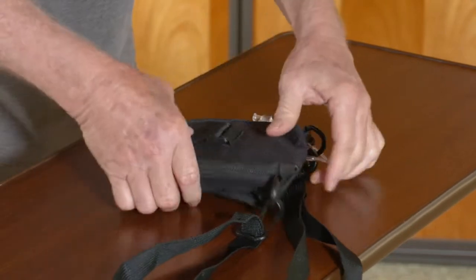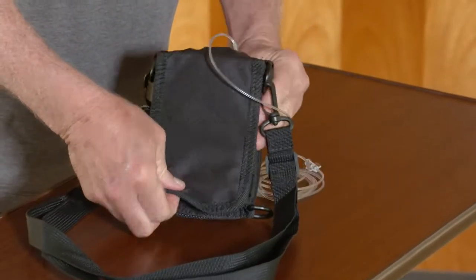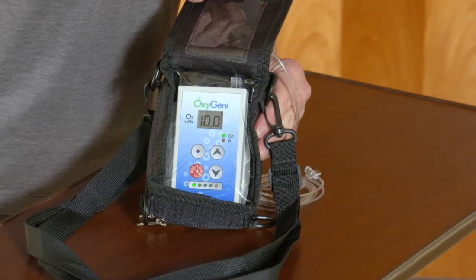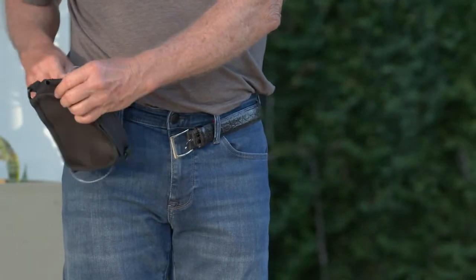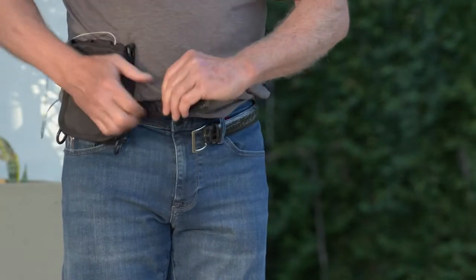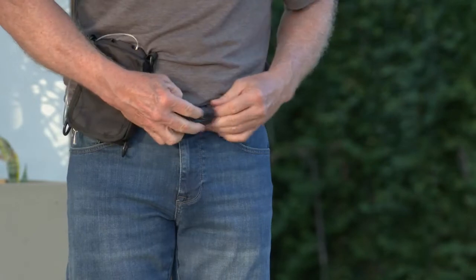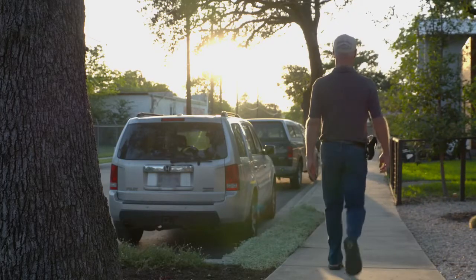You can then turn the case over and flip up the velcro strap. This window allows you to monitor your Oxygeni without having to remove it from the case. Another option is to fasten the carrying case to your belt — thread your belt through the loop on the back of the case and fasten your belt as normal. Now that your carrying case is in place, you can go about your day.